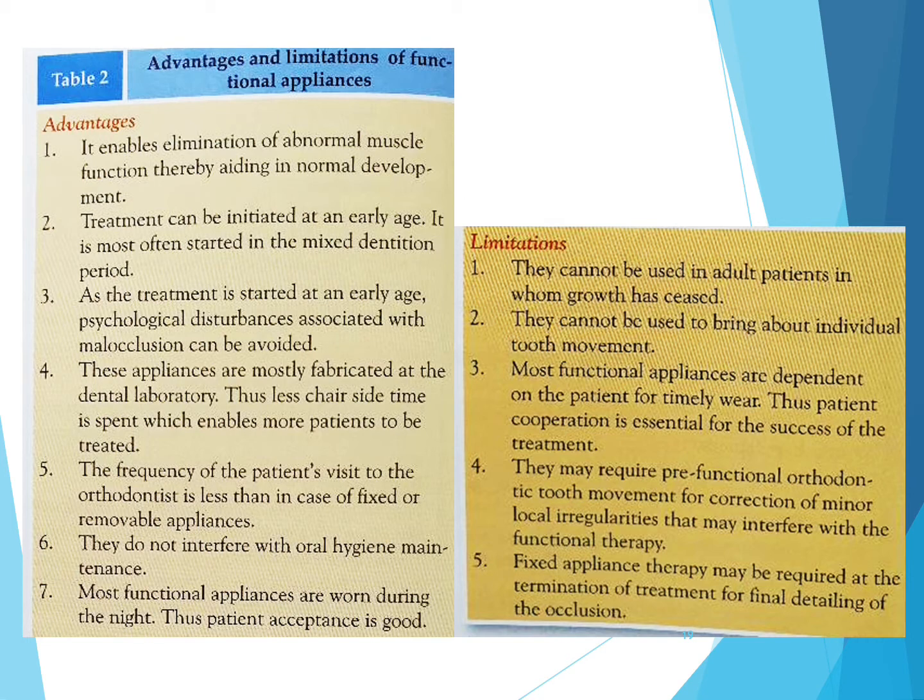These appliances are mostly fabricated at the dental lab. Thus, less chair side time is spent, which enables more patients to be treated. The frequency of the patient visit to the orthodontist is less than in case of fixed or removable appliances. They do not interfere with oral hygiene maintenance, and most functional appliances are worn during the night. Thus, patient acceptance is good.